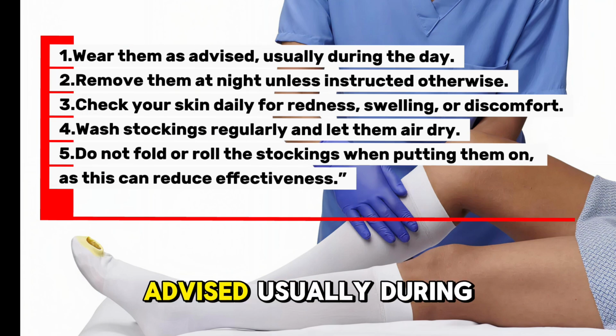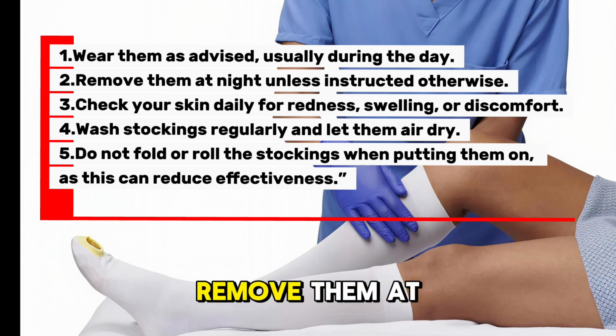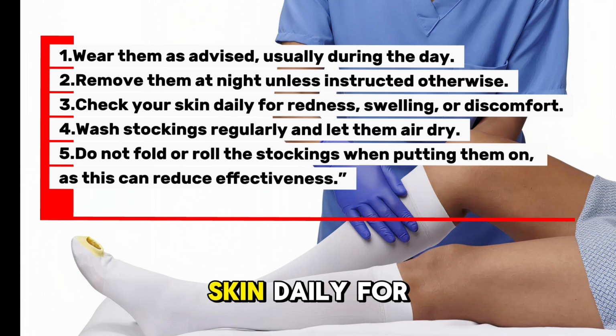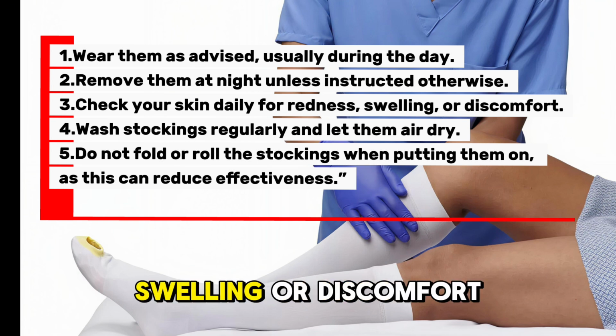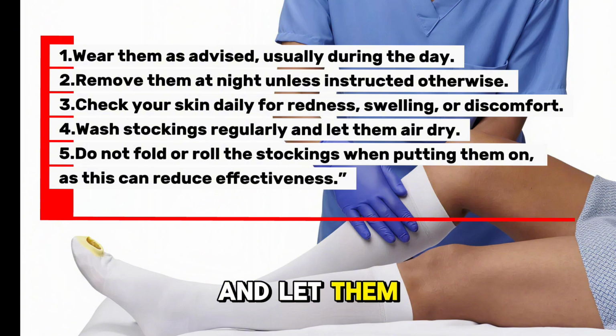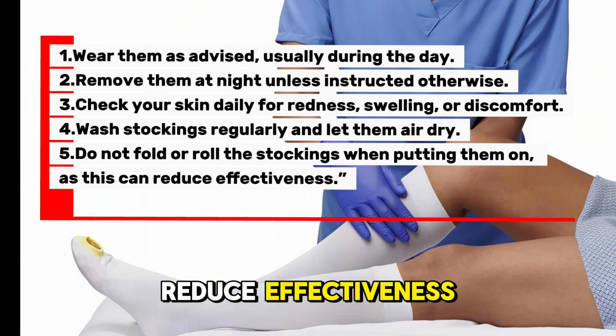Wear them as advised, usually during the day. Remove them at night unless instructed. Check your skin daily for redness, swelling, or discomfort. Wash stocking regularly and let them air dry. Don't fold and roll the stocking when putting them on, as this can reduce effectiveness.